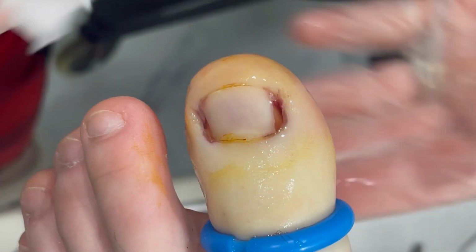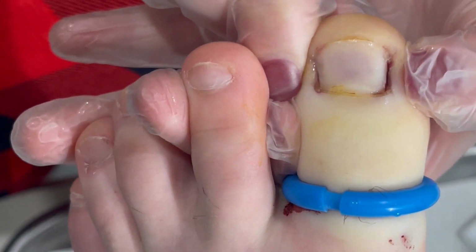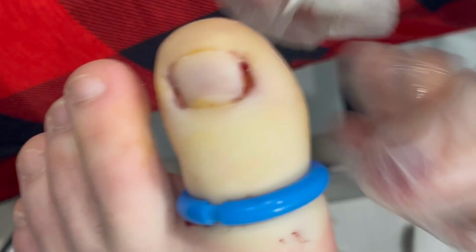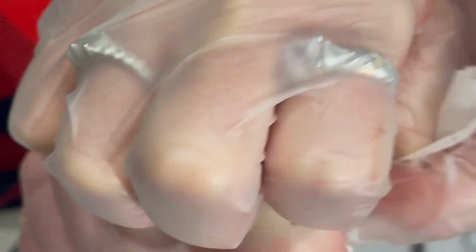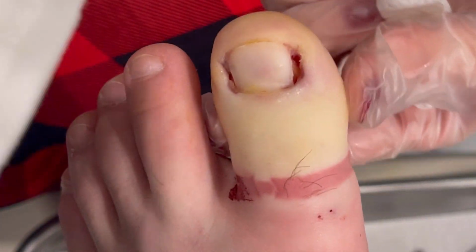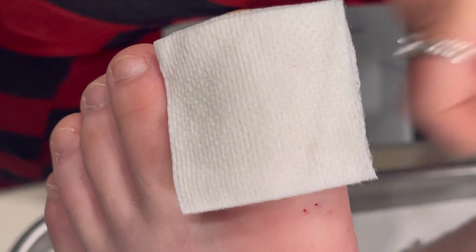Okay. Get it all cleaned. And so it's gonna fold over. It won't fold. That's what it will look like. So not a whole lot different at all than when he first came here. Only it's gonna feel much, much better. He's gonna have nice straight margins on it that hopefully will not bother him. Gosh, oh, look at that. Do you see that? That's from the tourniquet. Jeez, oh, honey. It's where your toe got so thick and tight.